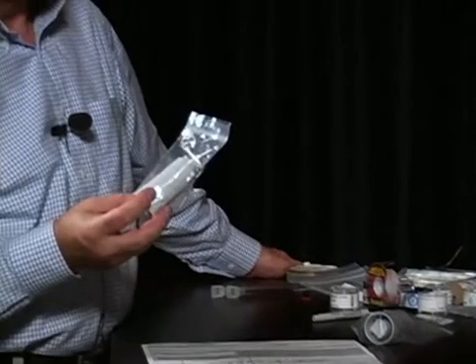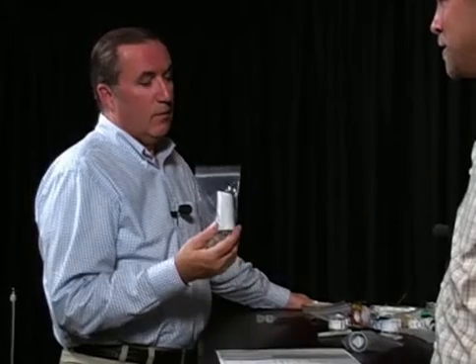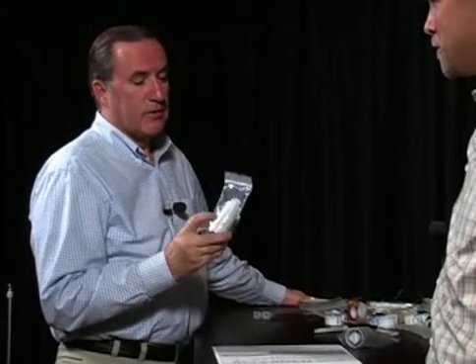Once you've taken a sample, if you're not going to send it in that day, you should refrigerate or freeze it. Why? Because it's got all the dust, skin cells, fungi, as well as the mites. The mites will continue to reproduce and grow, and so it may amplify the number of allergens beyond what was on the original surface. So if you're not going to send these directly in, refrigerate or freeze them so the dust mite allergen doesn't amplify. That slows them down. It'll stop them. That's right.